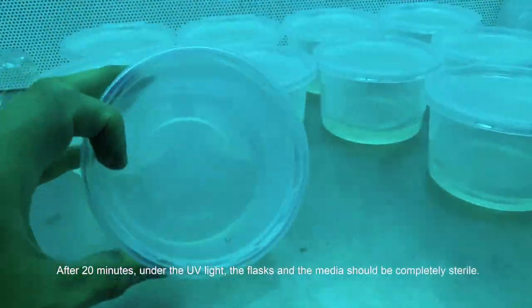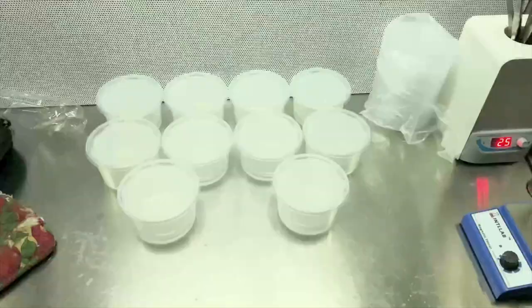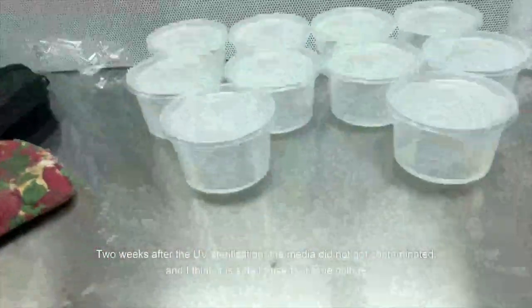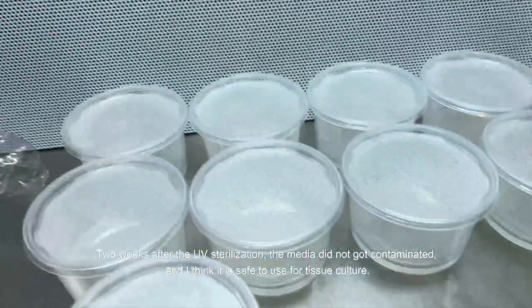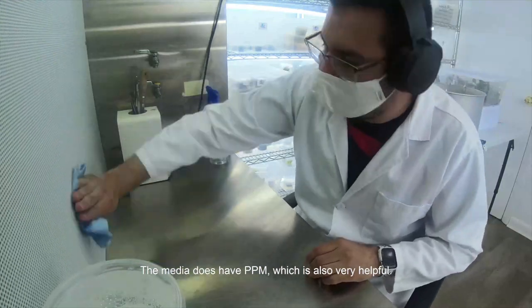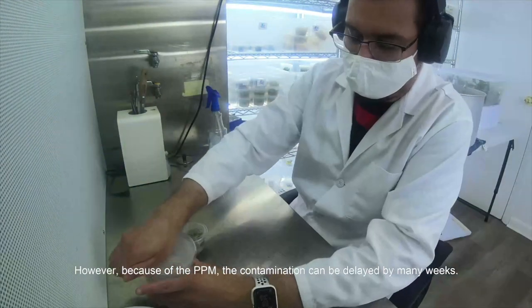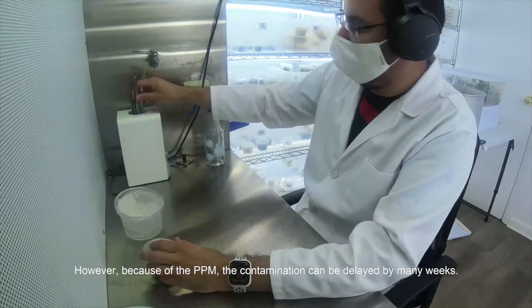After 20 minutes under the UV light, the flasks and the media should be completely sterile. Two weeks after the UV sterilization, the media did not get contaminated, and I think it is safe to use for tissue culture. The media does have PPM, which is also very helpful. However, because of the PPM, the contamination can be delayed by many weeks.